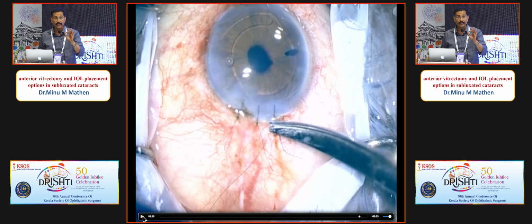And if it is loose, if it is smaller than your white to white, that is more problematic. There is more pseudophacodonesis, and the pseudophacodonesis itself can cause aberrant currents inside the anterior chamber. It need not directly touch. It can change the direction of aqueous flow inside. It's all turbulent always, and it causes long-term endothelial damage. Otherwise, nothing happens to the endothelium.